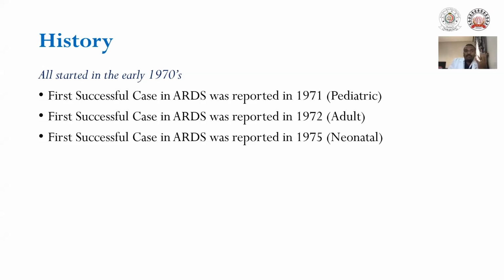It all started in the 1970s with ECMO. I'm talking about ECMO in particular, not the history of cardiopulmonary bypass. It started in the 1970s when Baffes and his colleagues reported the successful use of extracorporeal membrane oxygenation as a support in infants with congenital heart defects after undergoing cardiac surgery.